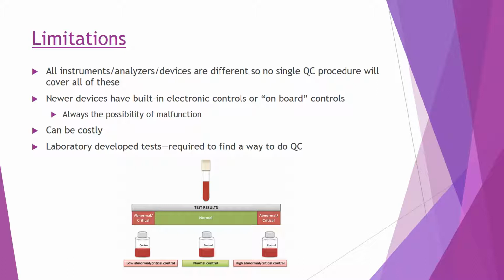Quality control programs all are going to have some limitations. All instruments, analyzers, devices, and so on are all different, and that means that all QC programs are also going to be different. This can make writing new QC plans or updating existing plans take a lot of time. So that's kind of a limitation. You have to have somebody dedicate time to that.